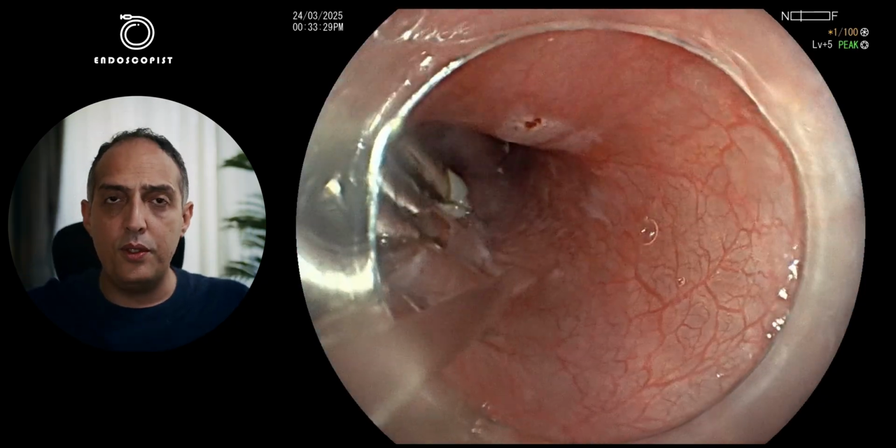After the procedure, I kept the patient NPO for 24 hours. He was only allowed to have sips of water. On the second day, he started clear fluids for 2 days and then slowly resumed a soft diet, then a normal diet. No pain after the procedure, everything was fine, and he went home on the second day. So this was an example of how POEM can be very effective, minimally invasive, with fewer complications and shorter procedure time.